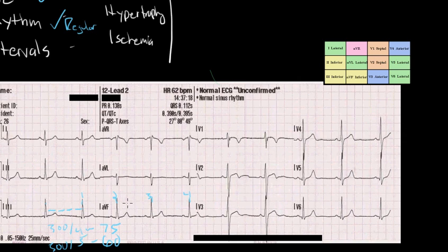If there was a lot of variation between this, if one beat to beat was shorter, and the next one was longer, and the next one was even longer, and the one after that was even shorter, and if it wasn't the same length, then that would give me an irregular rhythm. But here we have a regular one.